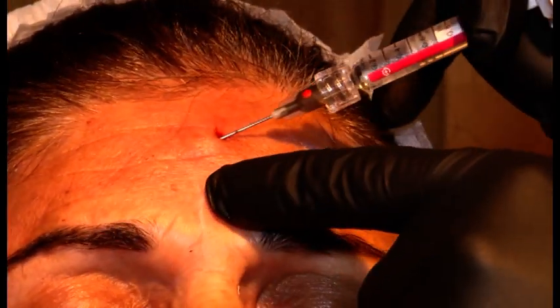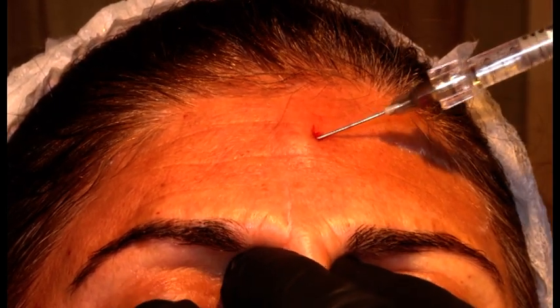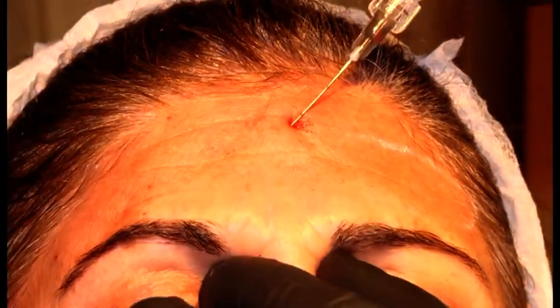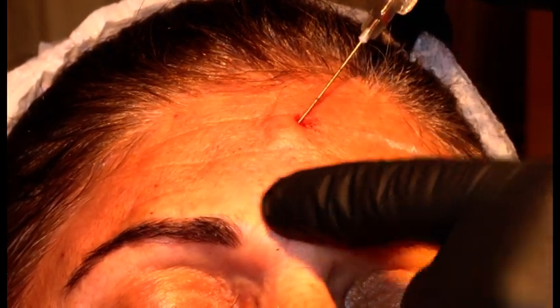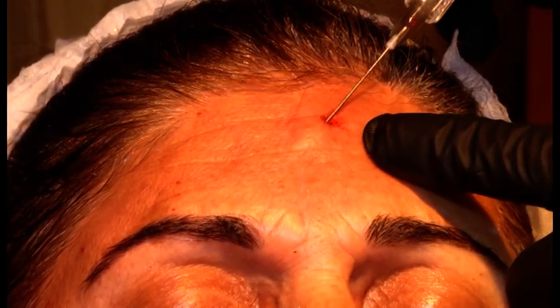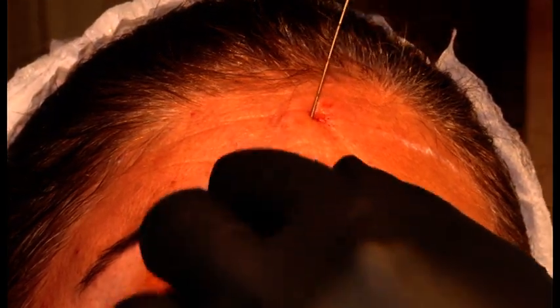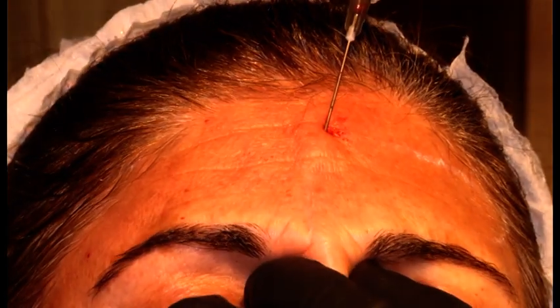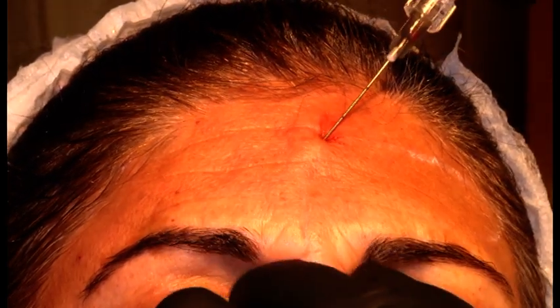All right, so it's good practice to keep on pressing those supratrochlear arteries. And whenever I feel a resistance, right now I feel a resistance, that means I hit the neurovascular bundle that is attached to the bone there. So I don't force it, I just start to inject small amounts, 0.025, and I am not in a hurry. And it may be a little bit sensitive.